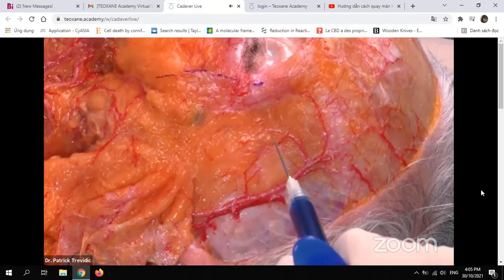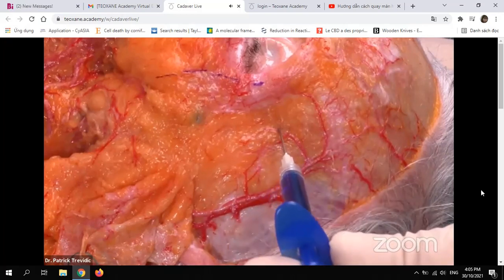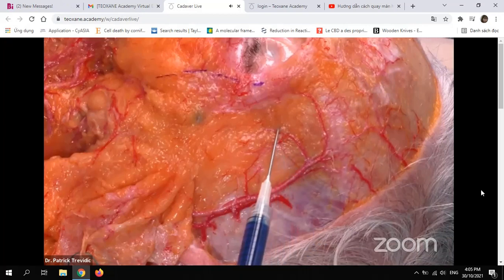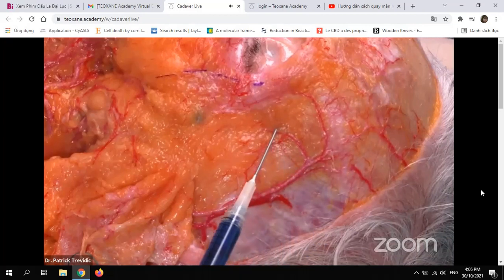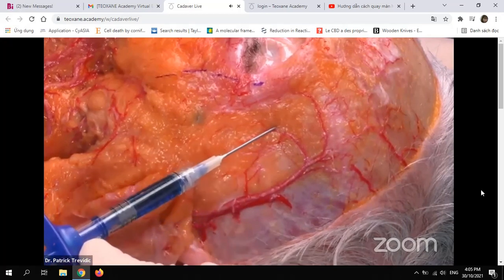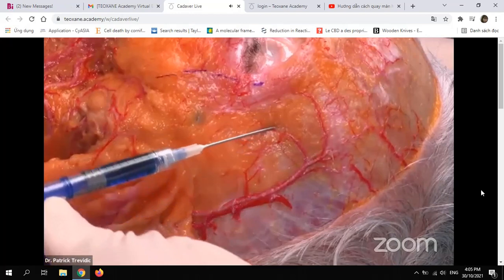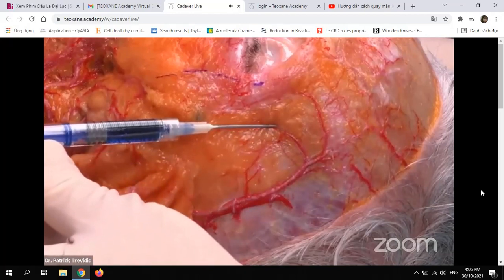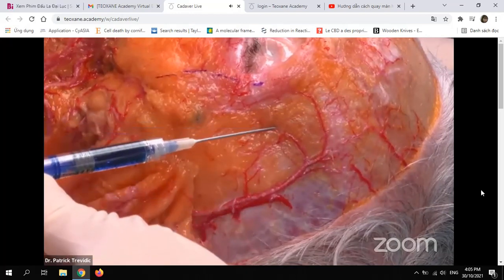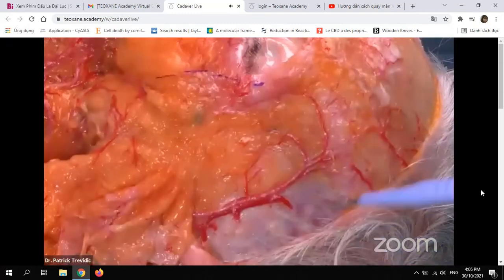So you put your needle straight down here, go on the bone, touch the bone, sliding a little bit bevel up, and I will do an injection of product here. I did an injection. Then Nabila moves her needle like a cannula technique, just to be on the bone each time, bevel down. And if I show you what happens with this injection, I still have a few seconds, I will show you.